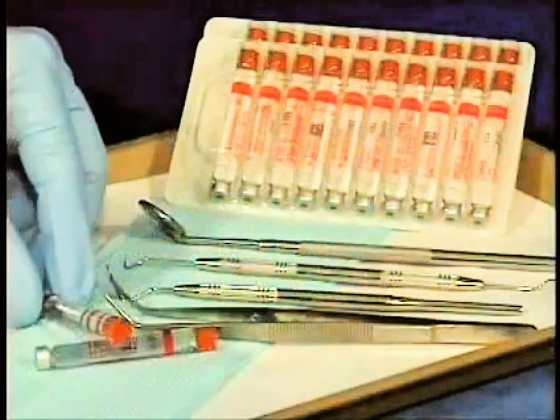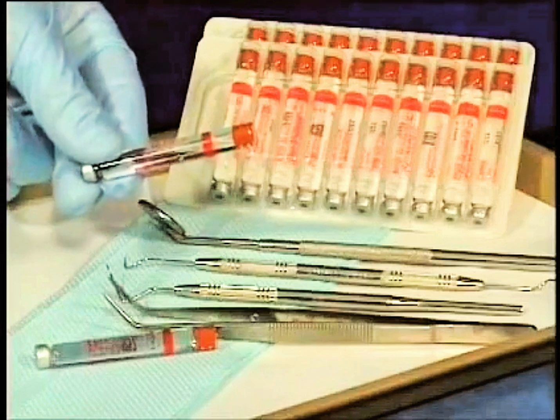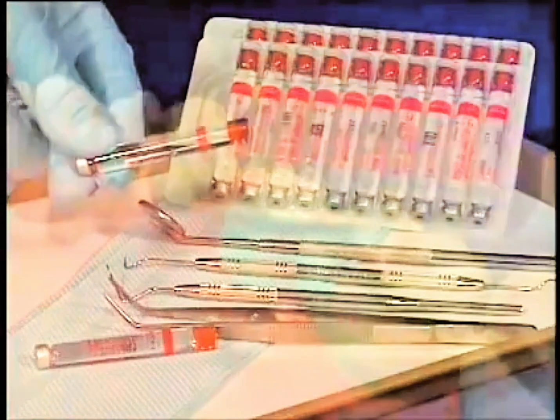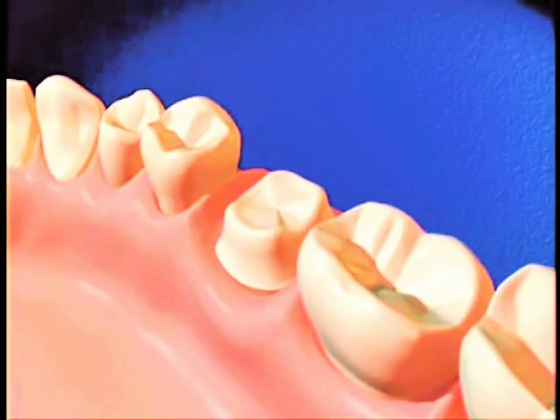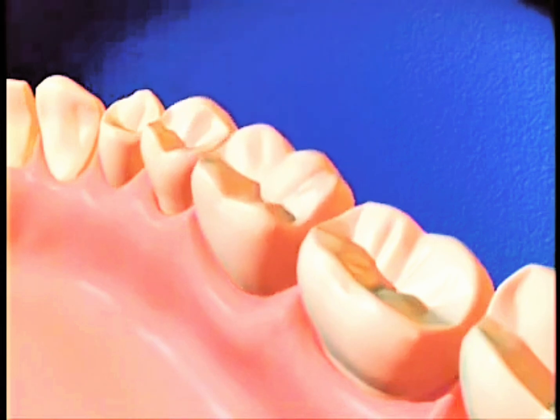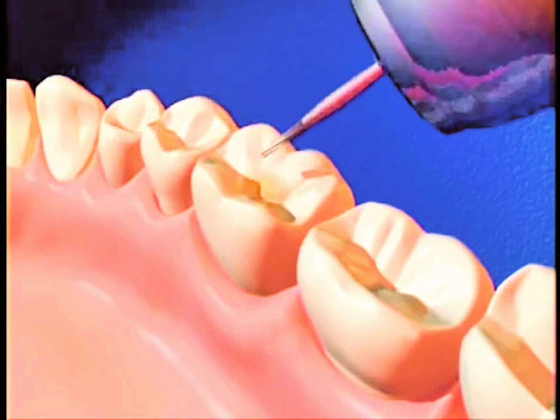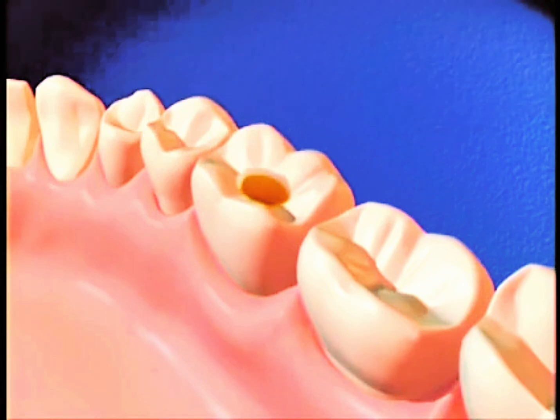We want the entire root canal procedure to be comfortable for you, so the first thing we'll do is make sure you're thoroughly numb. If you've had a crown placed on your tooth, it's been permanently cemented in place. There are a few options to choose from. In some cases, a small hole can be made in the crown to get at the infection, and the root canal can be performed through the crown.